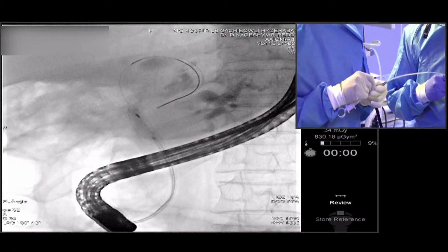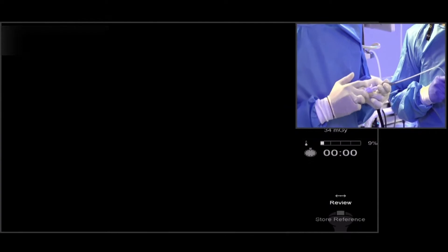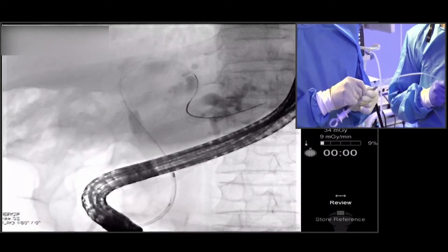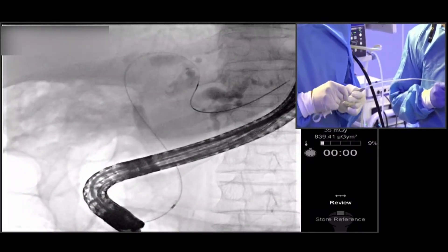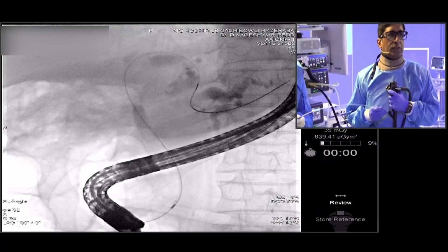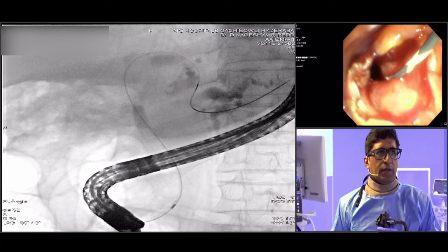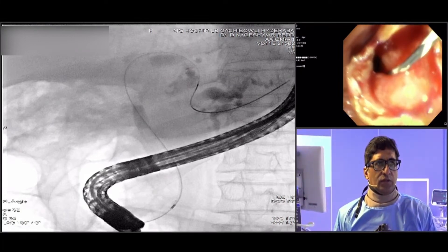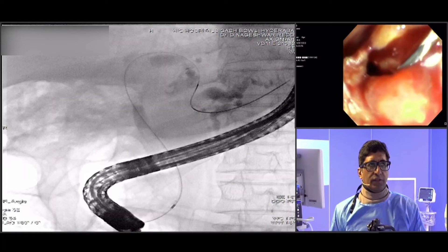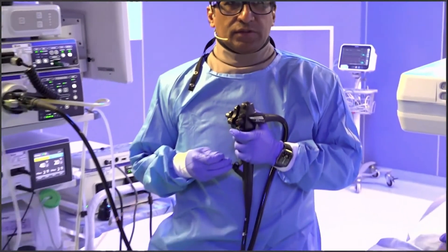Once adequate to-and-fro motions are done, we bring the brush inside the sheath and remove it from the channel of the scope. I will then give this to Dr. Anuradha, who is a senior pathologist at our institute, to demonstrate how she retrieves the sample from the brushing.